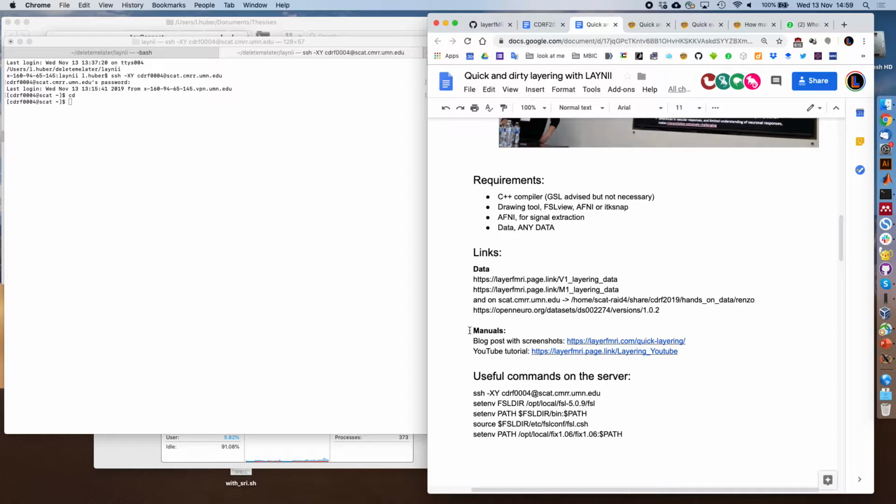So there are manuals there, and by the way, here I also have some background. The schedule changed a bit since yesterday, therefore what we go through today might be slightly different than what you find on the destination of those links.